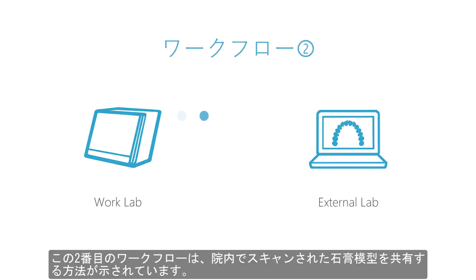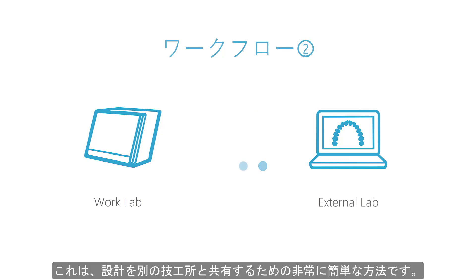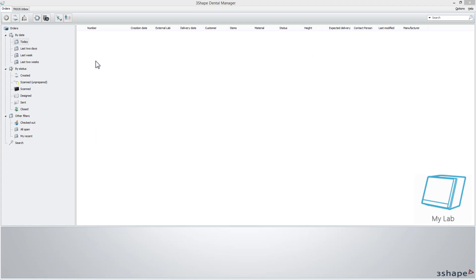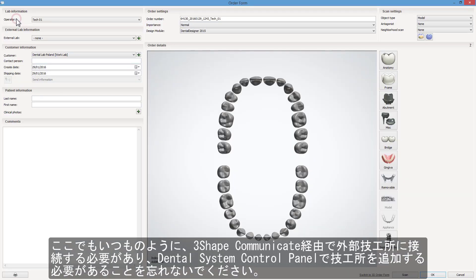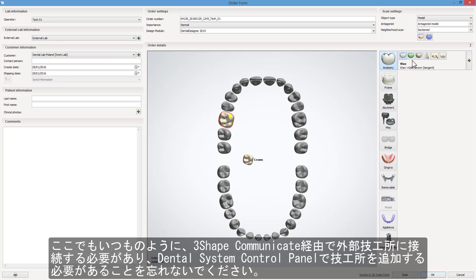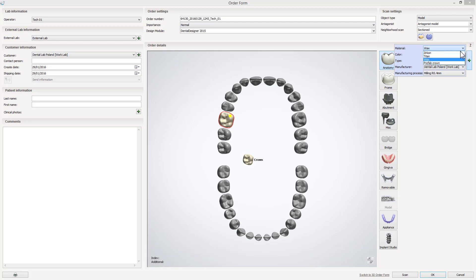This second scenario shows how to share gypsum models scanned in-house. It is a really easy way to share your designs with another lab. As always, remember that you need to be connected with the external lab through 3Shape Communicate and that the lab must be added in the Dental System control panel.